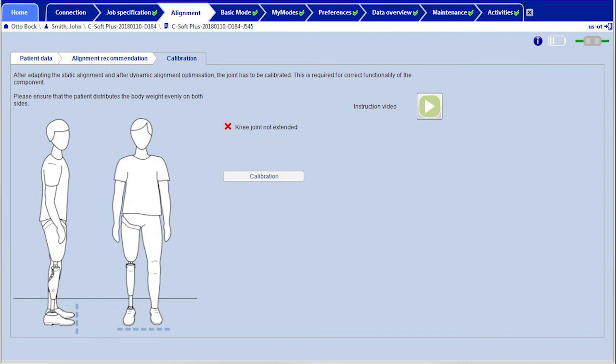Take into account any hip flexion contracture which may be present during the prosthetic alignment by ensuring the correct flexion position of the socket and check the foot position.